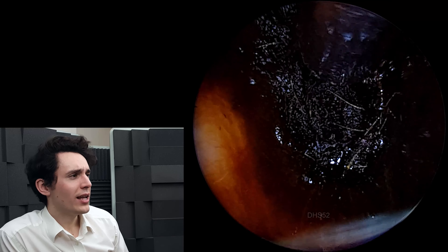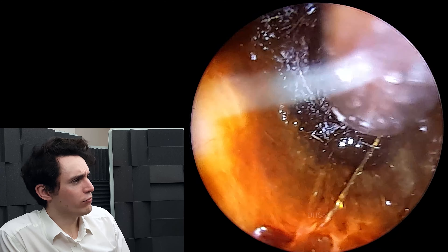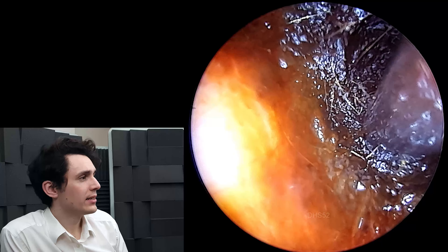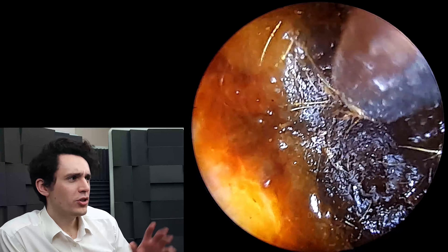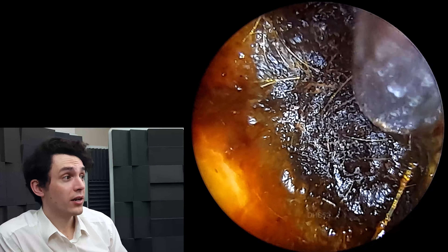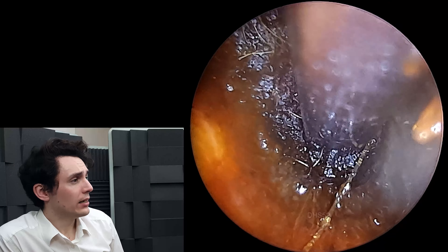I've applied some olive oil just to help loosen everything up and lubricate the ear canal, but this is really going to take some patience. Going back in with the regular suction probe, I'm just trying to catch it from the side, just trying any technique really to strip away these layers. The suction machine at this point was cranked up fairly high — hovering around minus 500 millimeters of mercury. It's a fairly powerful machine, but even with all that power, it is still struggling.